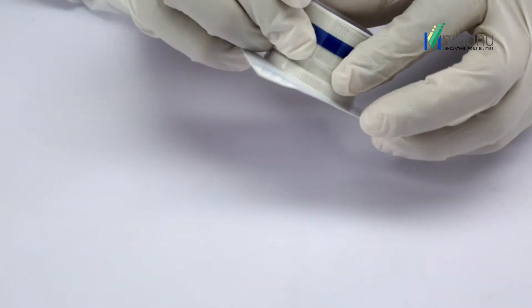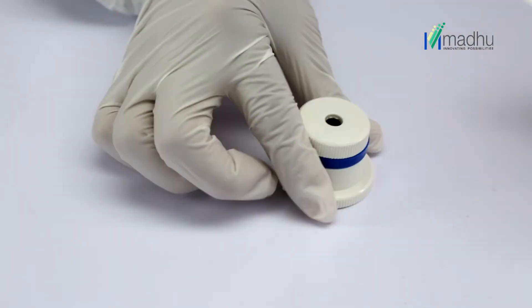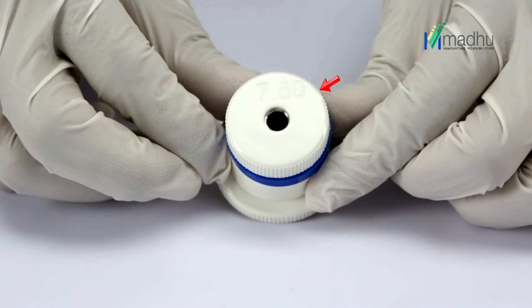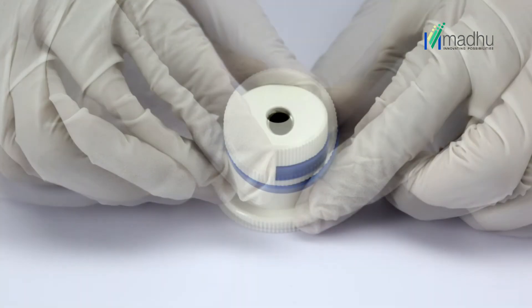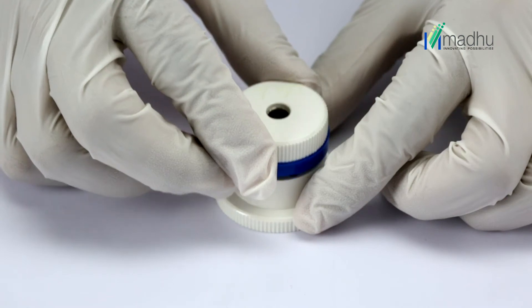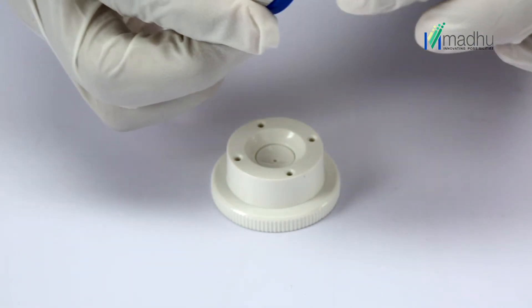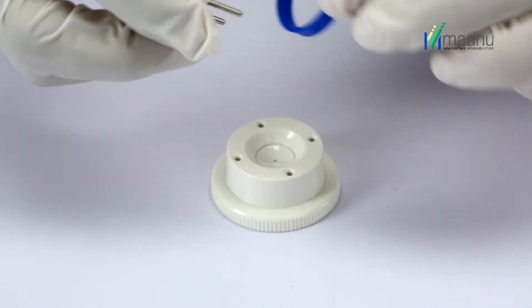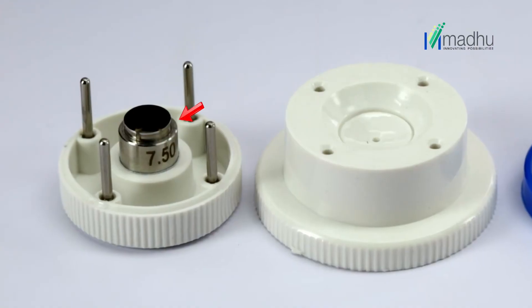Take out the trephine punch assembly from the inner blister and verify the blade diameter, which is engraved on the trephine punch top. Hold the cutting block base with one hand and pull the trephine blade housing upward with the other. Turn it over, carefully place it on a sterile tray, and discard the blue spacer ring.